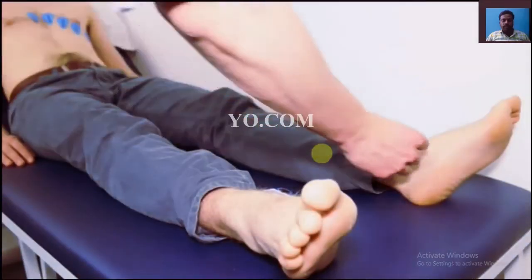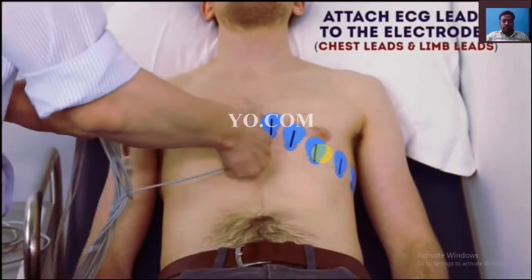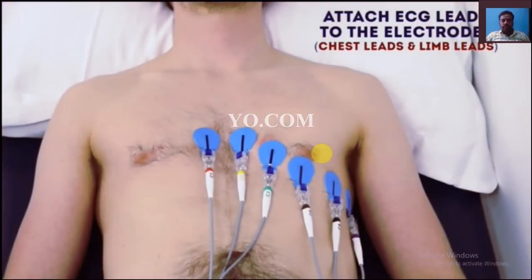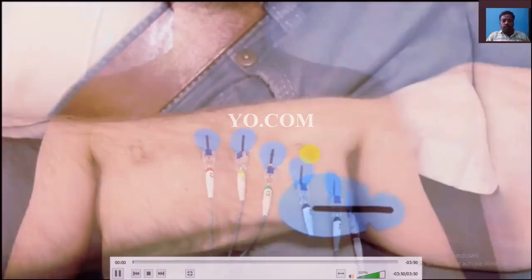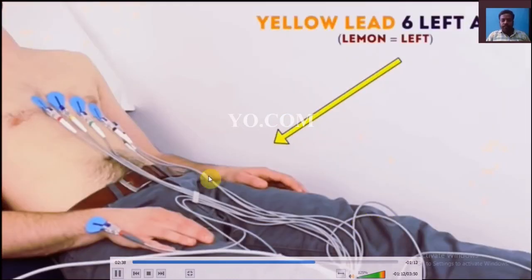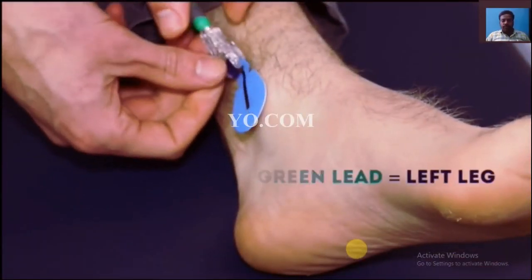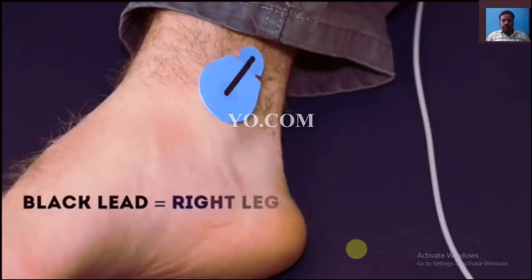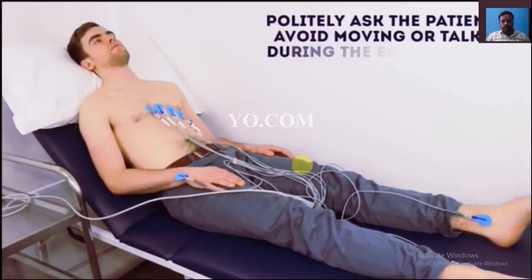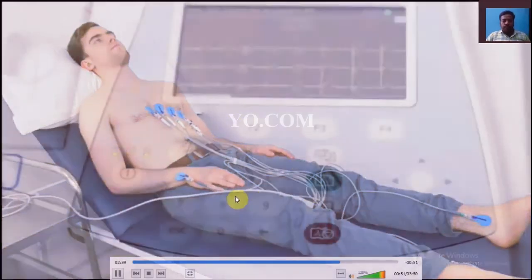This is a reference selector. Left arm, left leg and right leg we consider as a reference selector. So these are the leads. The blue color ones are electrodes. This is a lead. Okay, these are lead wires. These lead wires are connected with the recorder. A simple surface electrode. So this system is called the lead system.